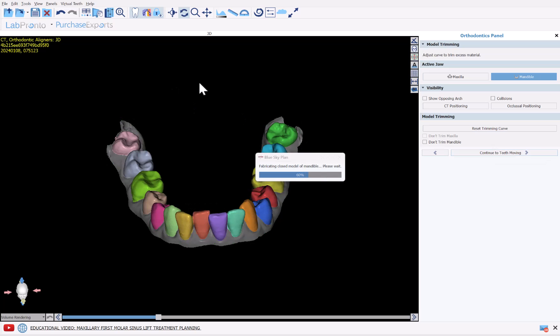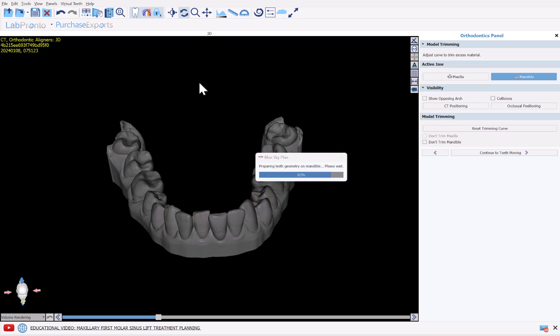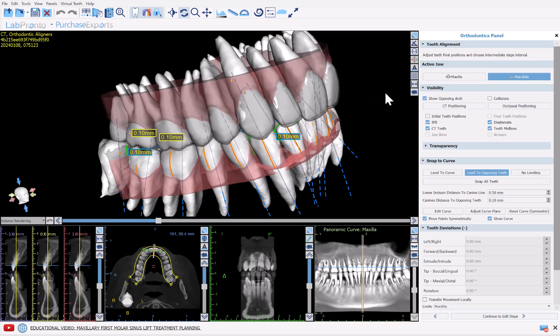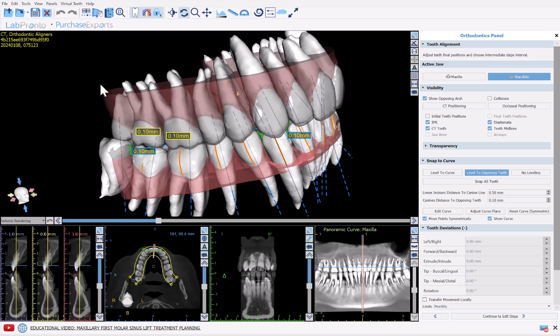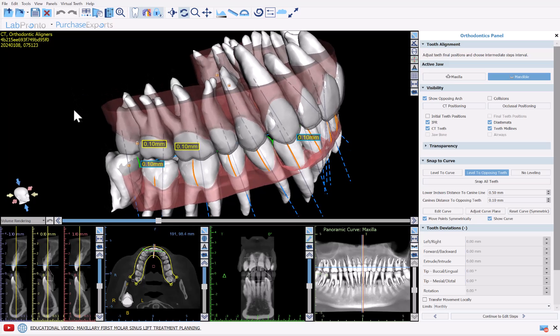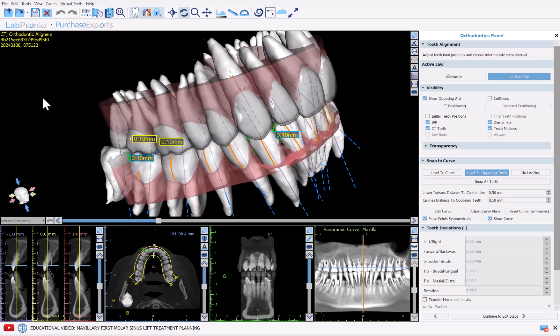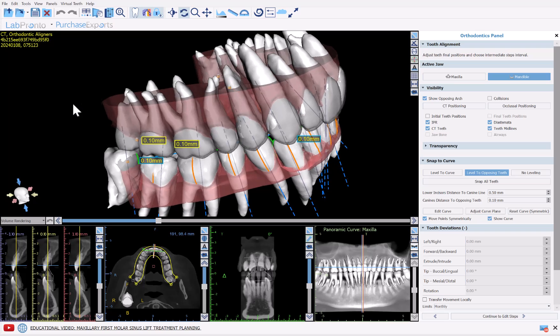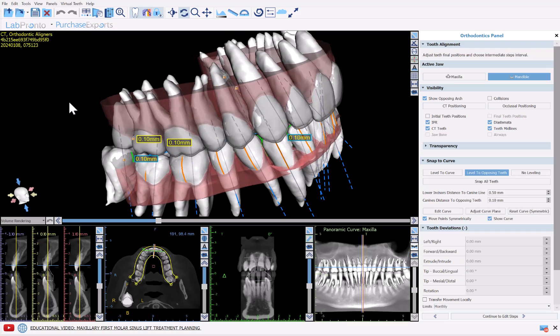We do have different settings in the options part of the software where you could essentially adjust the height of the model base that's going to be added as we see on screen now was just created. So for whatever reason you feel the base is too high or too short, you should know the options exist where you could customize that in the Ortho Options in the software. OK, so now we can see that we're at the step in the process where everything has been loaded, the data has been loaded, merged, segmented, cleaned up, the models have been cleaned up.